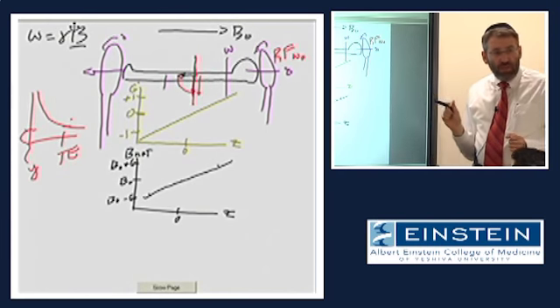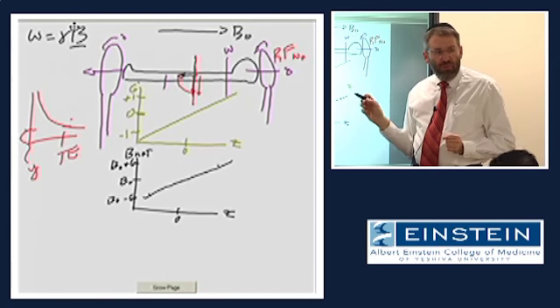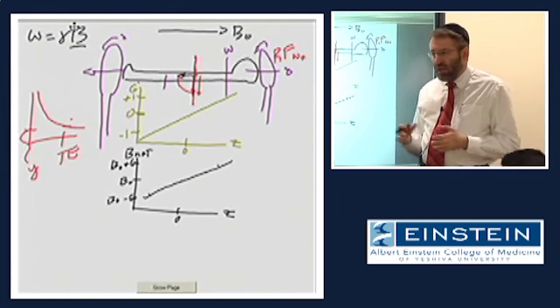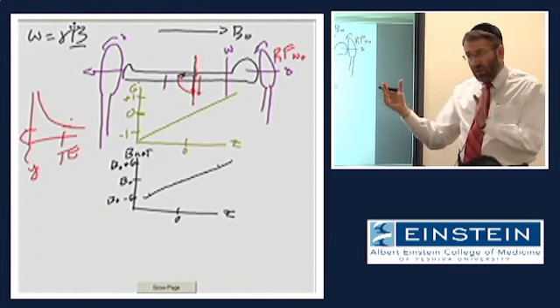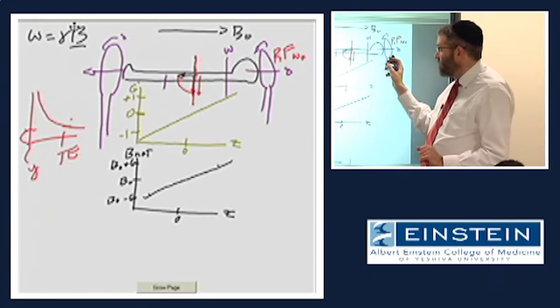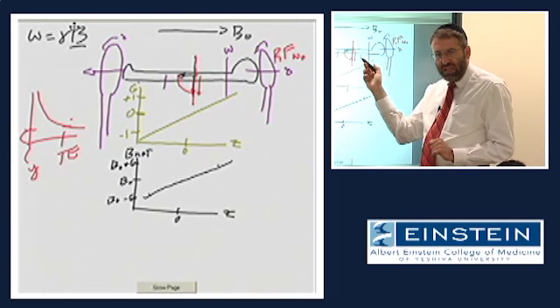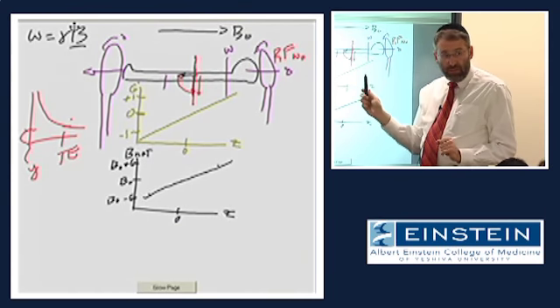But remember yesterday that we discussed that there are 3 orthogonal gradient magnetic fields. Any scanner you buy without paying anything extra, you will always get 3 orthogonal gradient magnetic fields. One in the z direction, one in what's typically called the x direction, left, right, and one in the y direction, top to bottom.